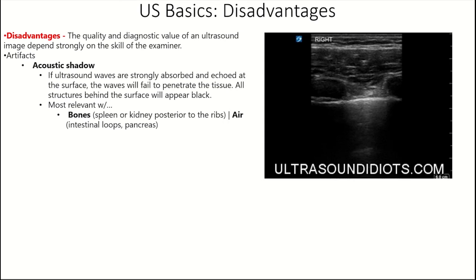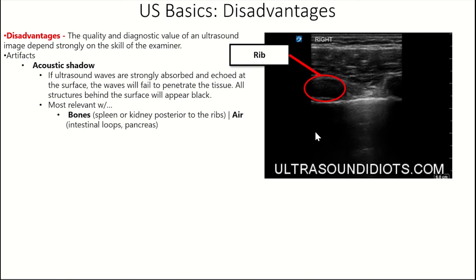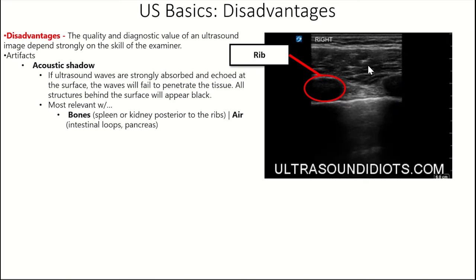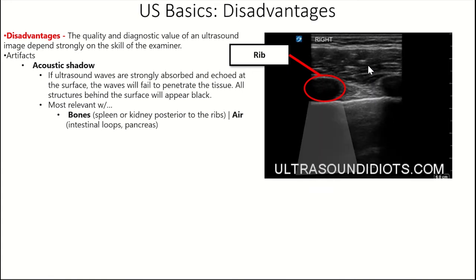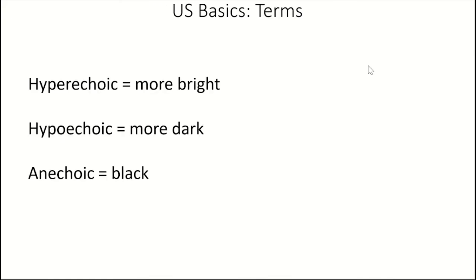To depict acoustic shadowing, in this video on the right we can see some ribs, and that large anechoic area behind them where we don't see much is the acoustic shadow. Make sure you fan around these things to get a clear image of what you need to see. Some basic terms: hyperechoic means more bright, hypoechoic means more dark, and anechoic means black.